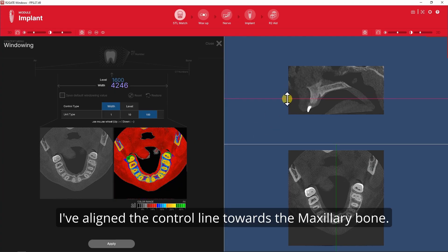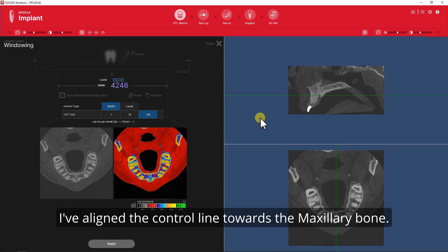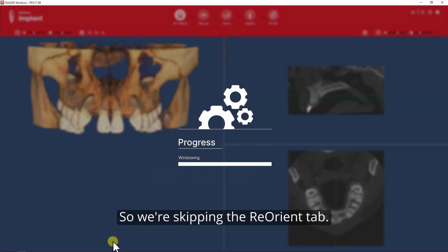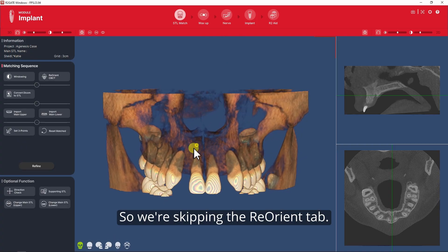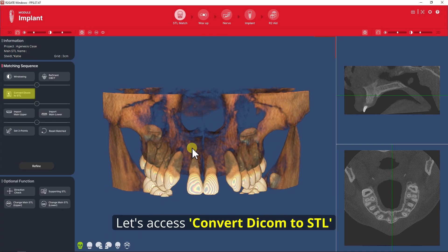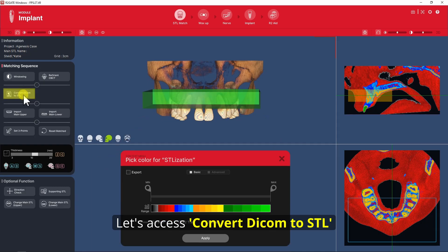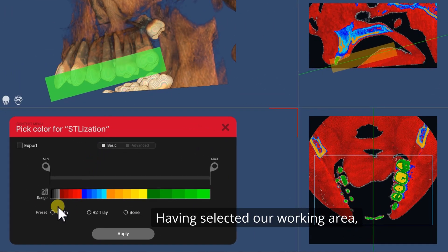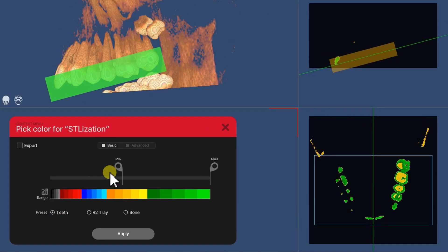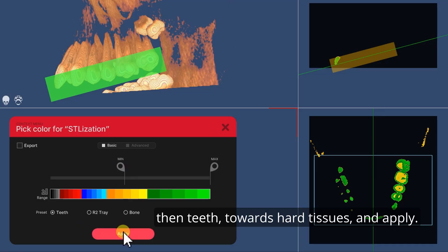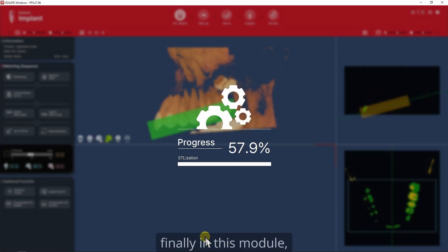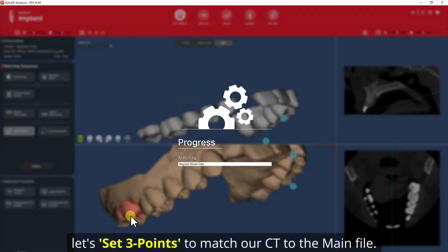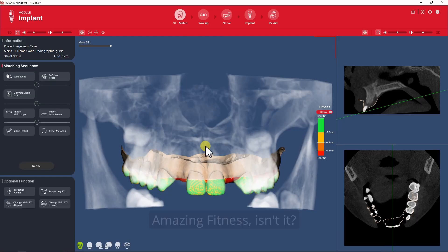I have aligned the control line towards the maxillary bone. This CT has a high accuracy so we're skipping the reorient tab. Let's access Convert DICOM to STL, having selected our working area, then teeth towards hard tissues and apply. Finally in this module let's set three points to match our CT to the main file.